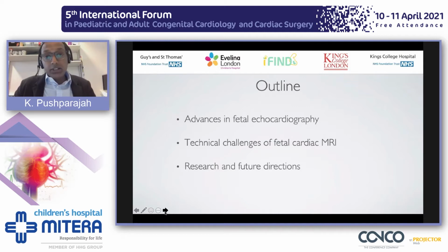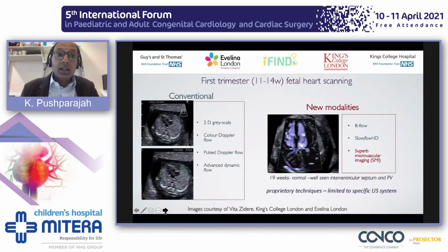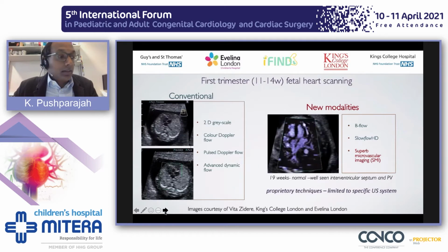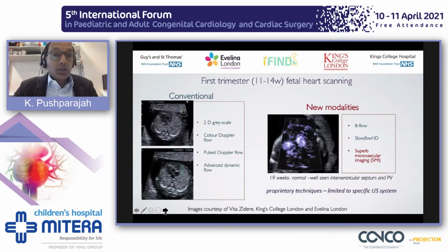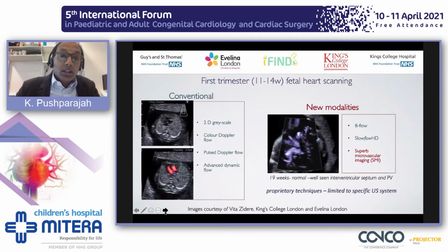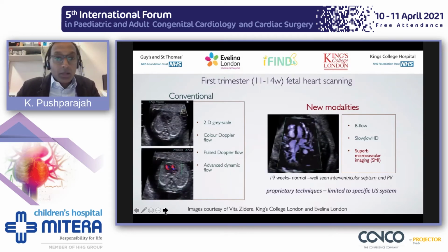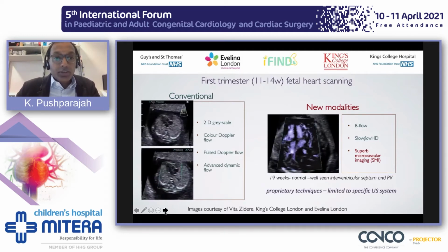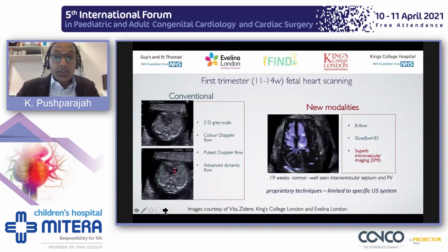I've included some fetal echocardiography, but a lot of my focus here really will be on fetal cardiac imaging, which is where my expertise lies. I've spoken to my colleagues in the fetal department, and I said to them, what do you find useful that you do in day-to-day clinical practice now that you didn't do a little while ago? And one of the things they shared with me was, in the past, we all have in our cupboards the 2D grayscale, color Doppler, pulse Doppler for assessment of the fetus. And that works very well as a screening tool.